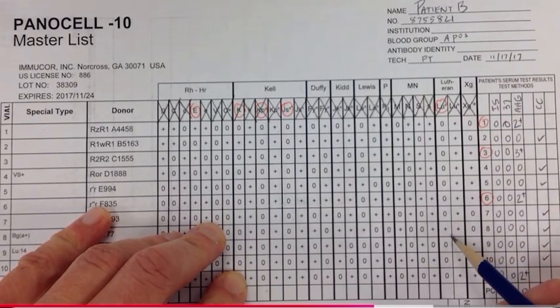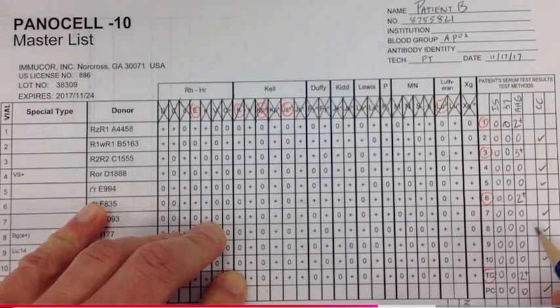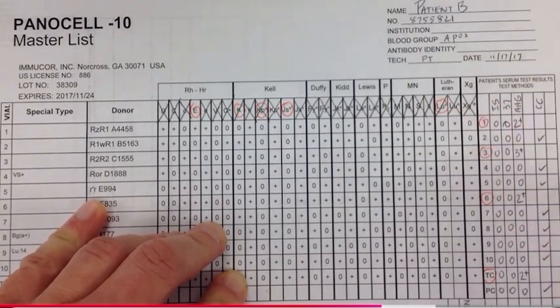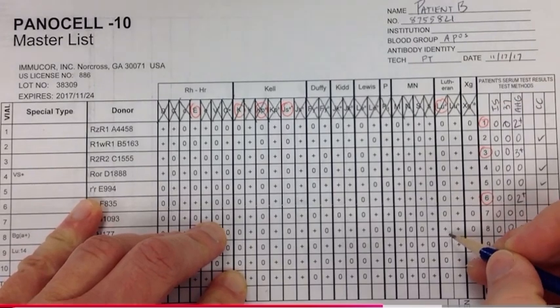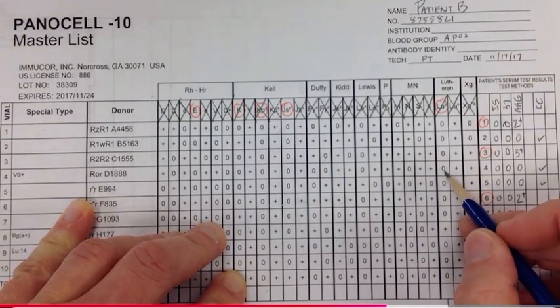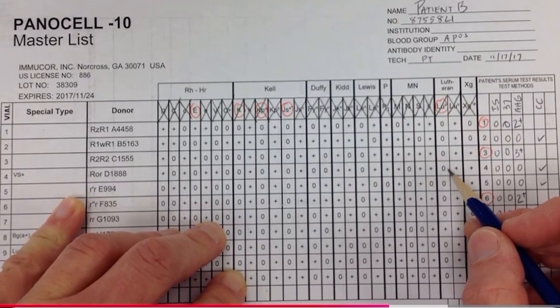Now it happens to be positive here in a completely negative. These are all negative reactions. Now when it comes to ruling out a cell or an antigen like this, it's better to have more than one heterozygous rule out. So if we had another one, like in cell 4, if this were positive, I'd be much more confident to rule this one out.